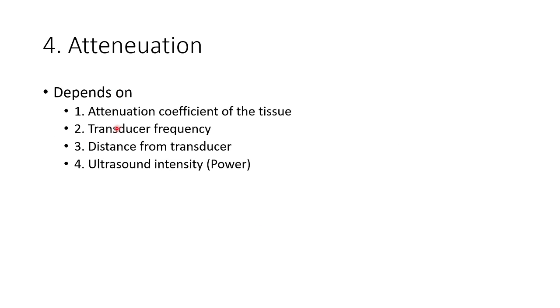Attenuation, that is where the ultrasound signal ultimately decreases in its intensity and ultimately dies off. So it depends on the attenuation coefficient of the tissue, the transducer frequency, distance from transducer, and ultrasound power.